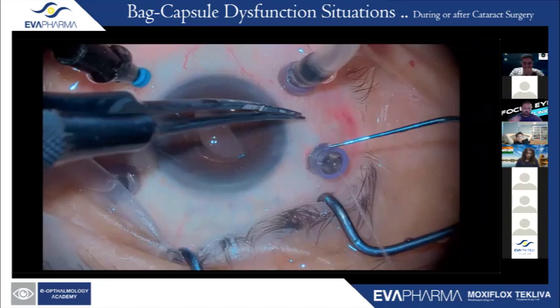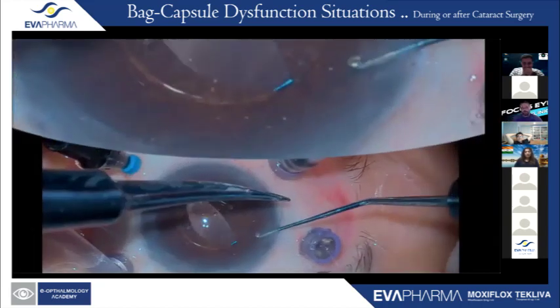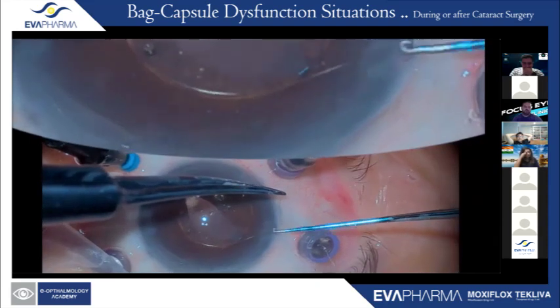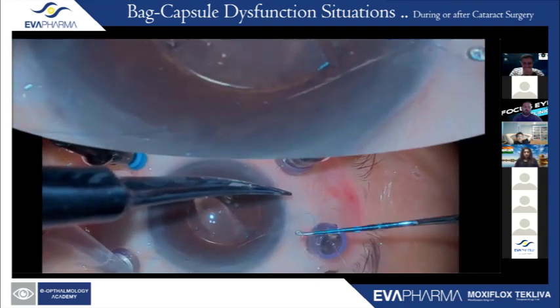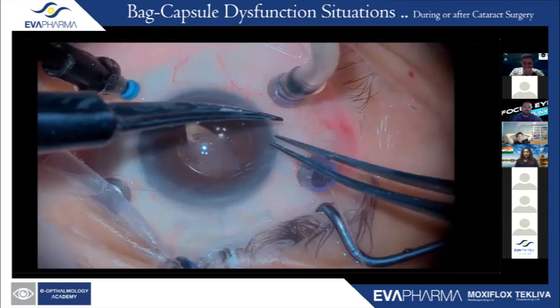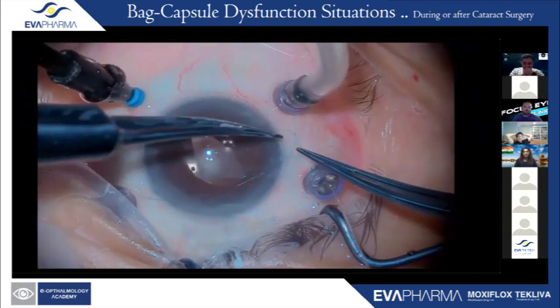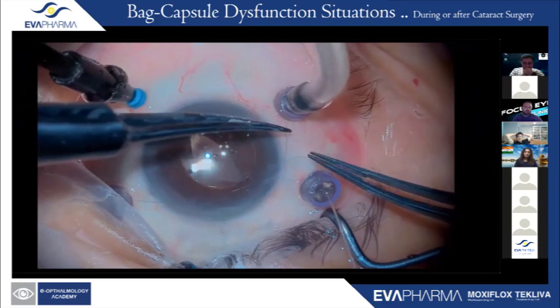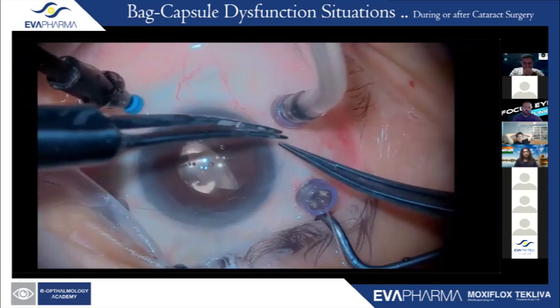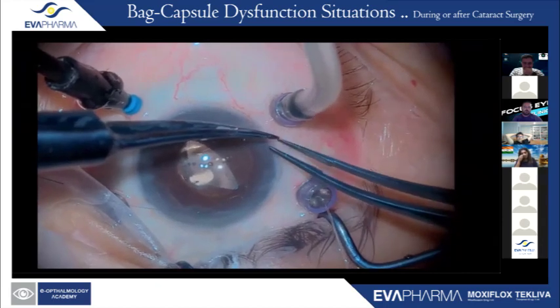I like to use my hook, which is horizontal, and it's really good in catching the internal suture. Again, the Siepser sliding knot. And as already pointed, we have infusion in the eye because it shouldn't be soft.